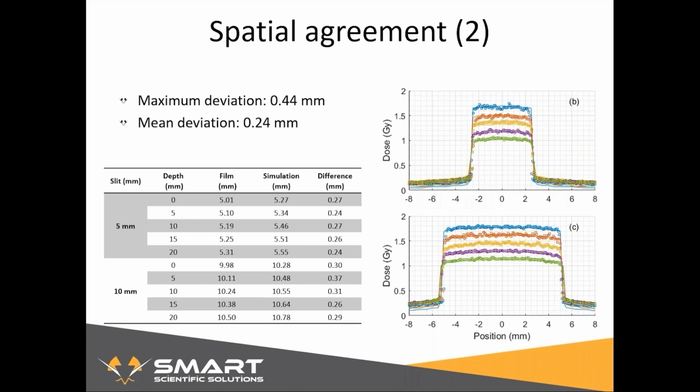non-image guided applications. We assume that the slight deviations are usually caused by differences in positioning, because you don't have a real reference point, and the voxelization within SmART-RAD, because when you're combining all those geometries and giving it to the Monte Carlo engine, it needs to pick a resolution, which here was 0.3 millimeter, and you get slight shifts in positions, but acceptable in this case. I will not go further into all the other results, but you're free to read the paper once it's published in Physics in Medicine and Biology.